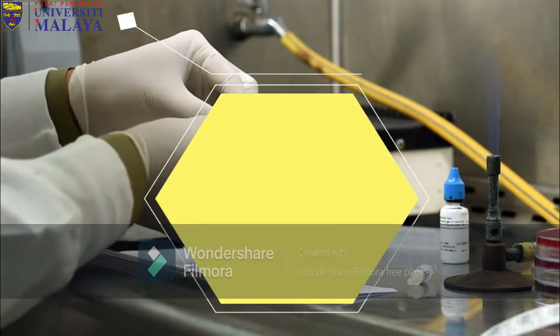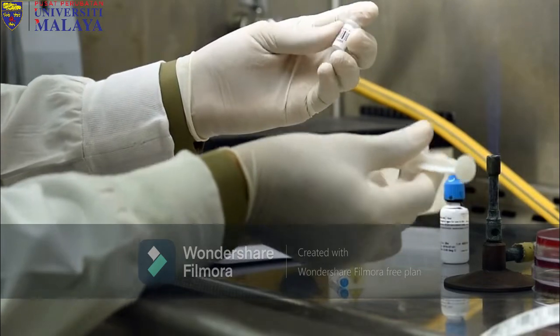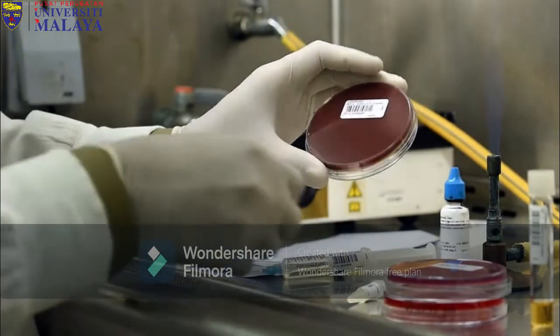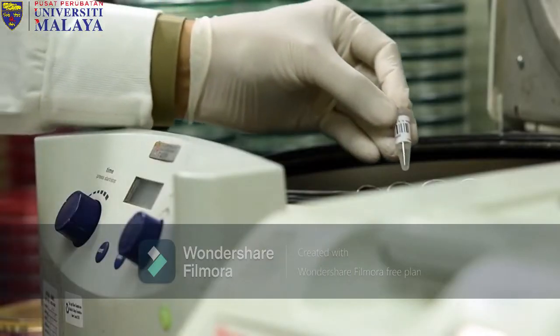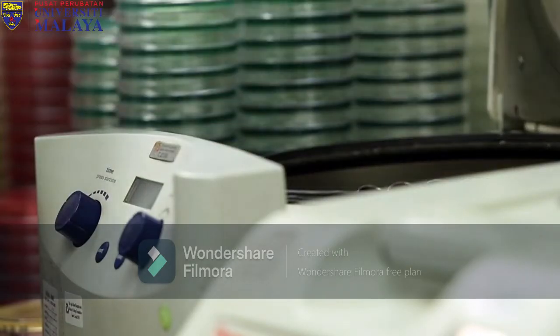CSF specimen. If the CSF specimen is less than 1 ml, it should not be centrifuged. Instead, the CSF should be plated directly onto the agar plate. If the collected CSF specimen is more than 1 ml, it must be centrifuged to sediment the bacteria. Centrifuge the specimen at 3000 rpm for 10 to 15 minutes.